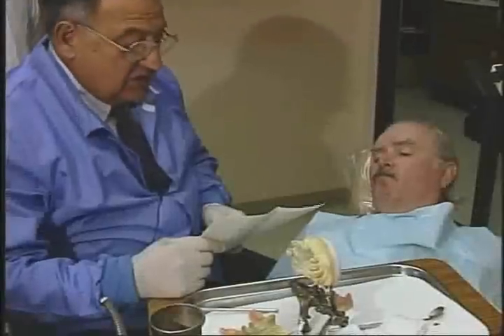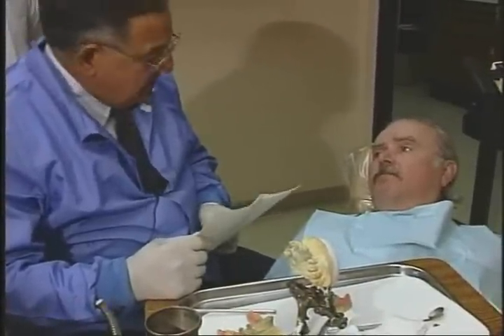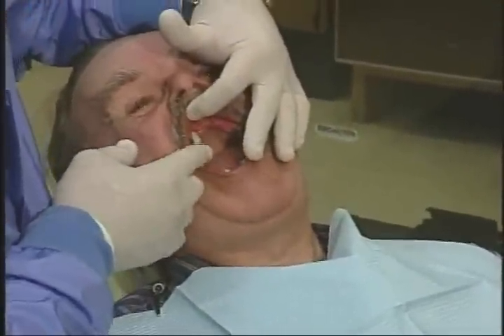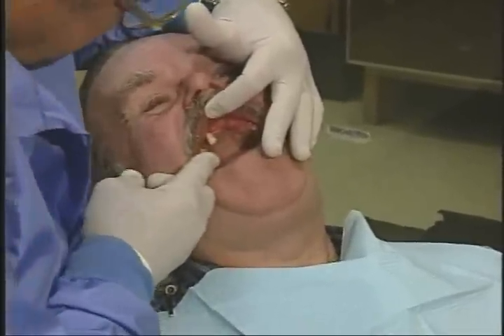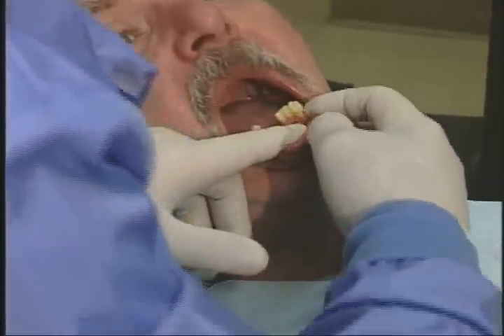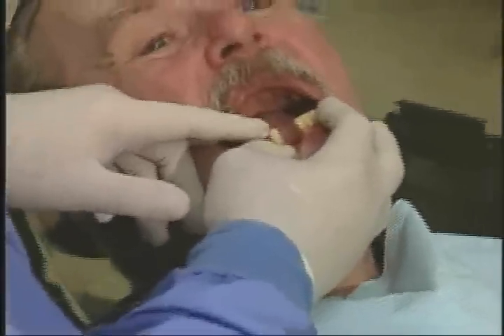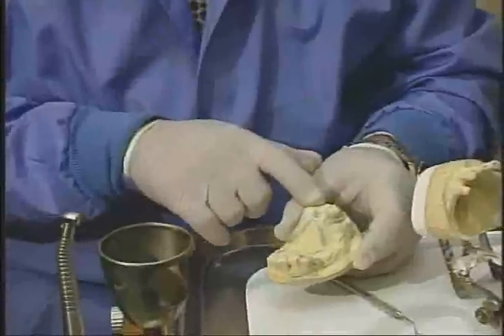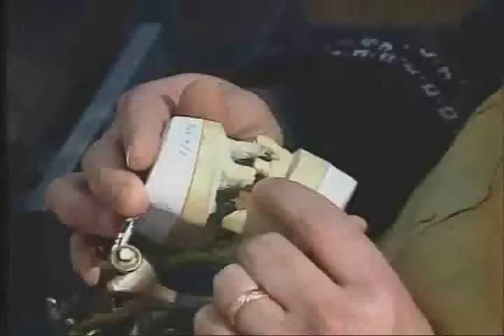In addition to this videotape, the Equipoise Institute recommends that you work with the Equipoise textbook, Equipoise: The Proven Partial Denture System. The textbook contains 153 line and color illustrations that help you quickly get an in-depth understanding of the Equipoise system, its basic designs, and its unlimited applications. Dr. Goodman will now demonstrate with a patient how easily the Equipoise system can be used. In a few pain-free visits, our patient will have an aesthetic and functional removable partial denture that will protect, preserve, and strengthen his remaining teeth.